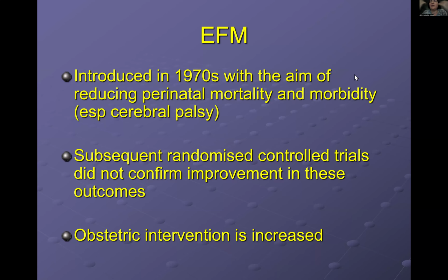I'm referring to older mothers and mothers with certain medical complications. So if electronic fetal monitoring shows that something might not be right, that triggers more obstetric intervention. Delivery is more likely to be expedited, whether by assisted vaginal delivery with forceps or vacuum, or by cesarean section.